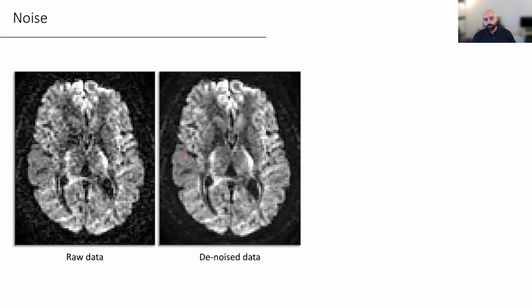And the more noise we try to remove, the higher the risk that we're also going to be removing meaningful signal from the image, because denoising data is a very difficult thing, especially since we don't have a magical thing that says this is just your noise map from the data, acquired as a separate thing. We have to estimate noise from the data itself. And the estimation has to be done in a way that balances this noise correction without removing meaningful signal.